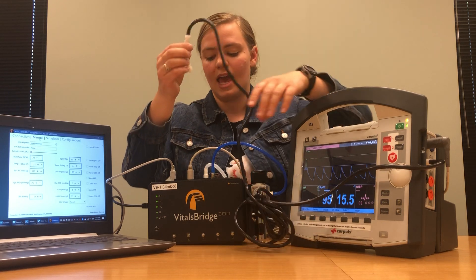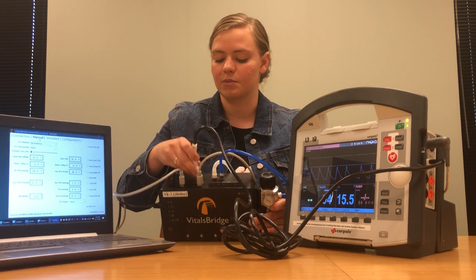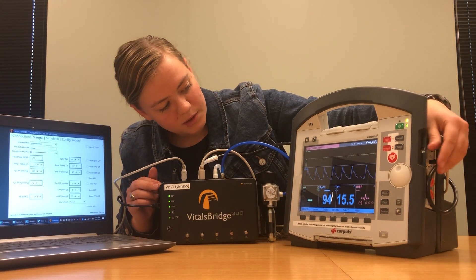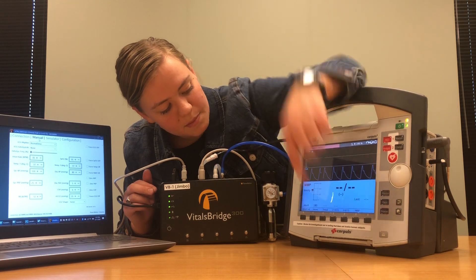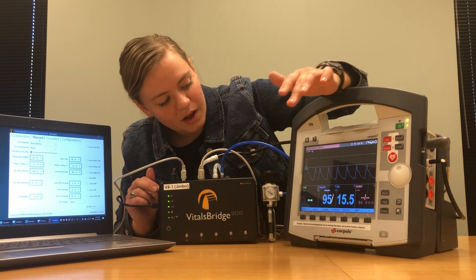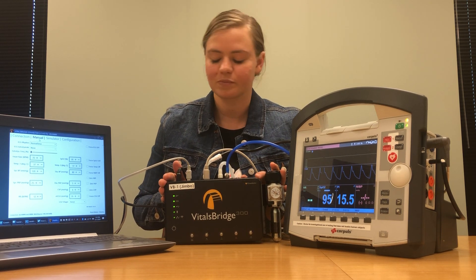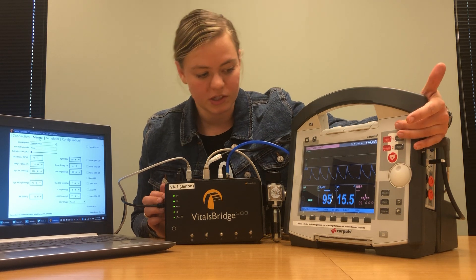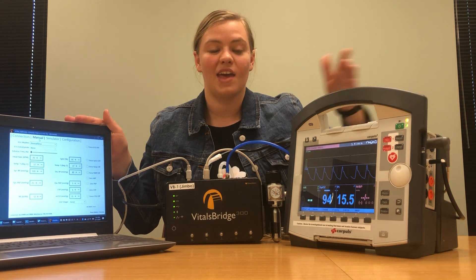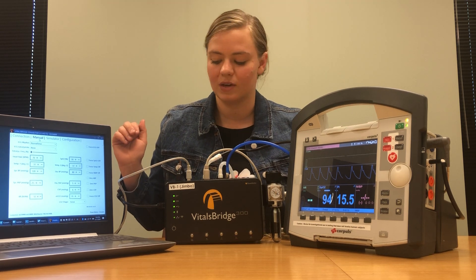Snap the adapter into place and then connect this cable right where it says NBP, non-invasive blood pressure. Once that's connected, you can take a non-invasive blood pressure reading by pushing NIBP and start. We'll close this window while it runs the reading — you should hear clicks from your VitalsBridge as it takes that reading. If you don't get a reading after your first measurement or if the reading isn't exactly what you put in your VitalsBridge, just rerun the non-invasive blood pressure reading and it should get to where it's supposed to be.